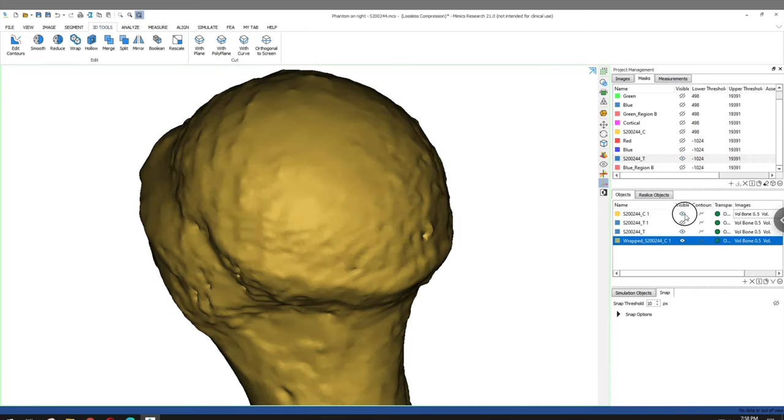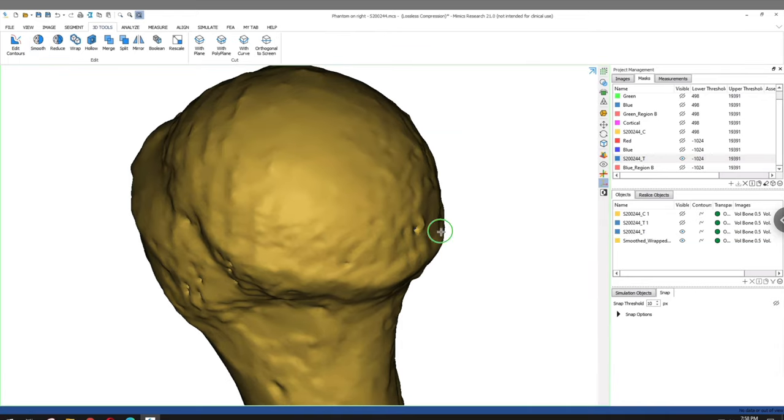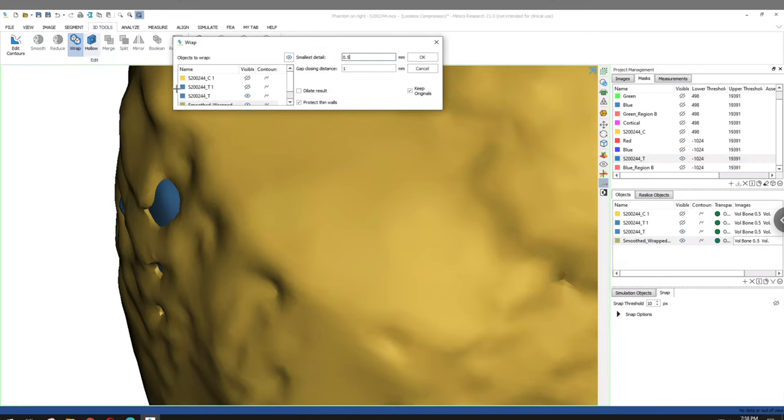And now inversely here, when we're working with our cortical shell, make sure that you instead select protect thin walls when you're performing the wrap function. And for your smooth function, you really want to compensate for shrinkage, as you don't want your cortical shell to begin to interfere with the trabecular bone model that you've already developed here.